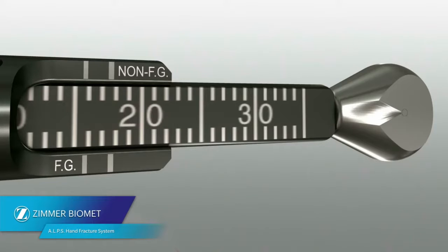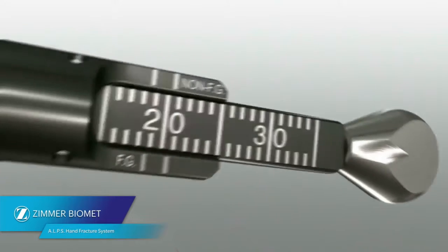For your convenience, the bone depth gauge has two measurement systems on the same side, depending on whether the tool was used through a fast guide or after the fast guide has been removed.